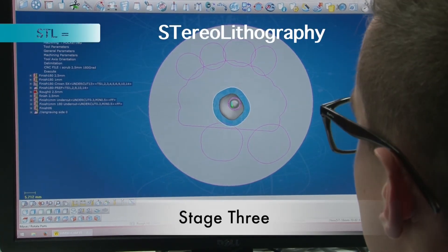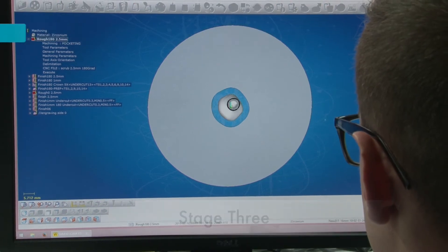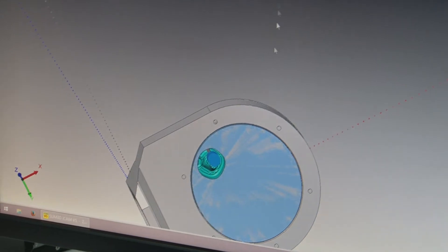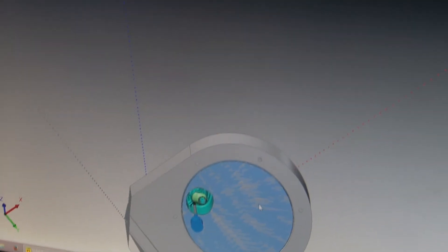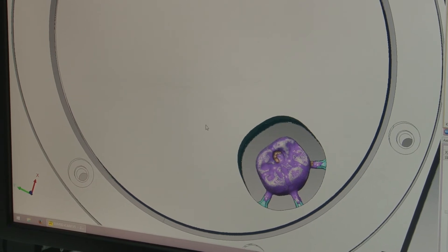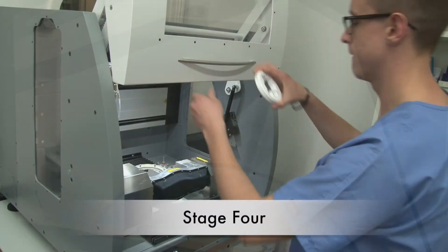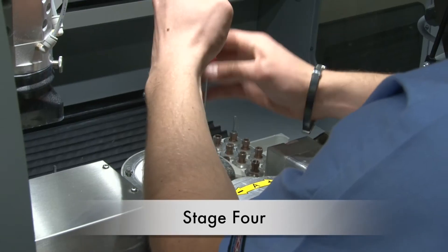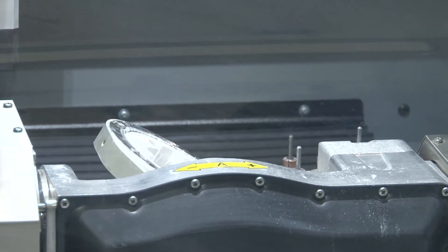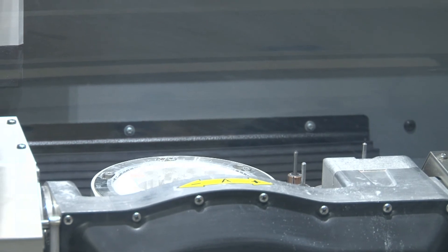Next, the STL file from CAD is imported into CAM software — computer aided manufacturing — where the restoration is placed in the zirconia disk and calculated to the ISO file. In the control milling unit software, the ISO file is opened and the disk is placed into a holder in the machine chamber, and the milling process begins.